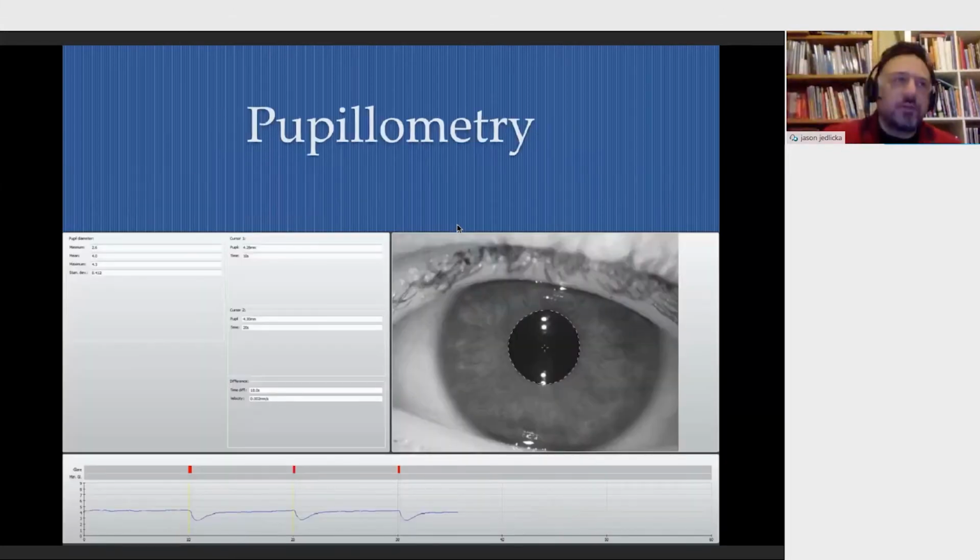Another thing that comes into play, particularly with multifocals, is pupil size and getting a good, accurate evaluation of pupil size in both bright and dim light. The pupillometry option is really great for this. What we have is the instrument itself lays dark and allows the pupil to dilate to its maximum size, and then the instrument will flash a bright light and the pupil will immediately shrink to constricted level, and then over a 10-second period will dilate back up to a dark light pupil size.